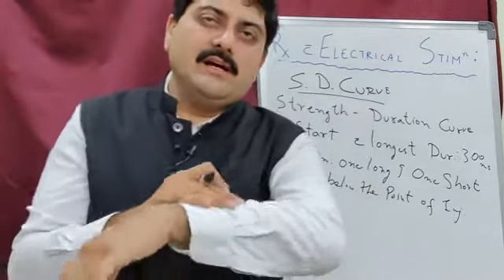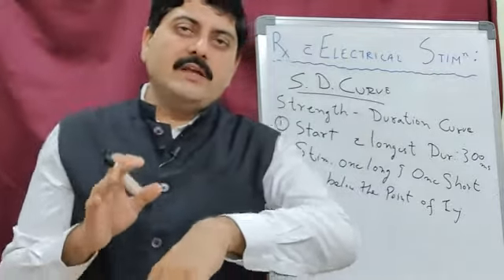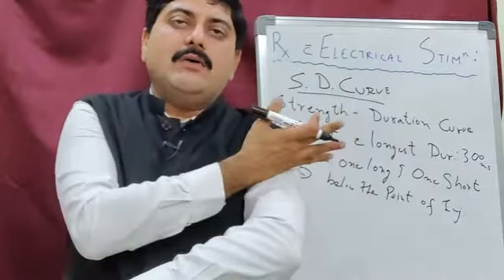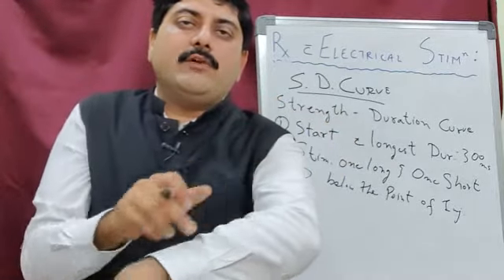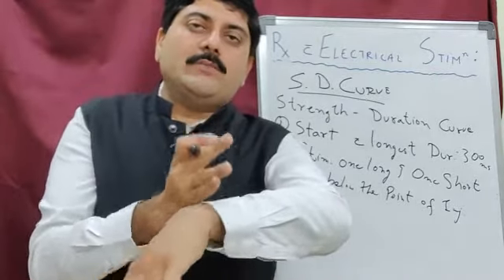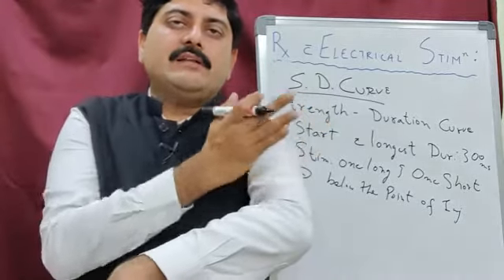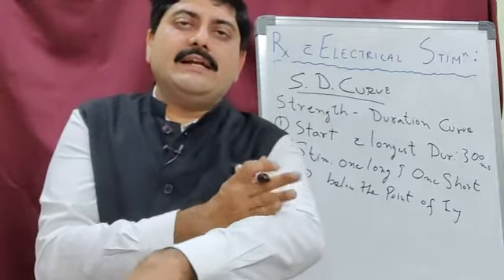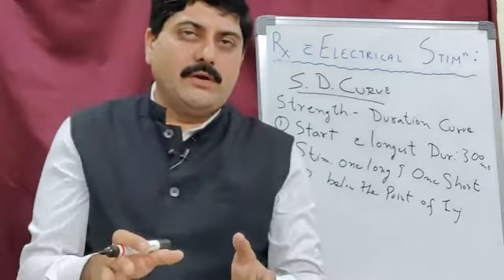So which nerve is involved when we talk about wrist drop? It is the radial nerve. So we have to stimulate one long muscle, and we'll stimulate a short muscle also. So we can find out whether the injury has occurred over here, or whether the nerve has pulled anywhere else, and this is responding normal, the longer muscle, but the shorter muscle is not responding normal.